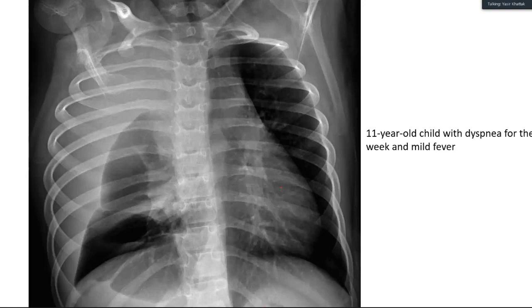There's a big difference between dyspnea and desaturation. If the patient is desaturating, you can consider these things. But if a patient who comes in walking, mildly dyspneic, and you take him to intubation. Okay, we leave it here. So the purpose of asking this question is, would you like to do any other radiological investigations? Yes, sir. I would go for a lateral X-ray chest. And how can the lateral chest X-ray help you?